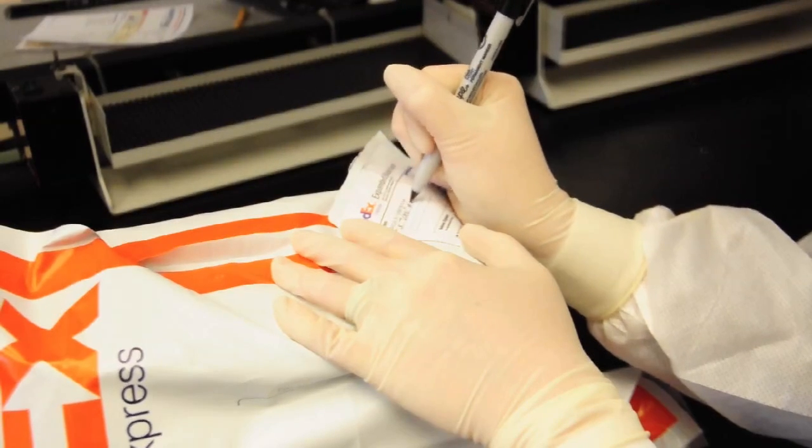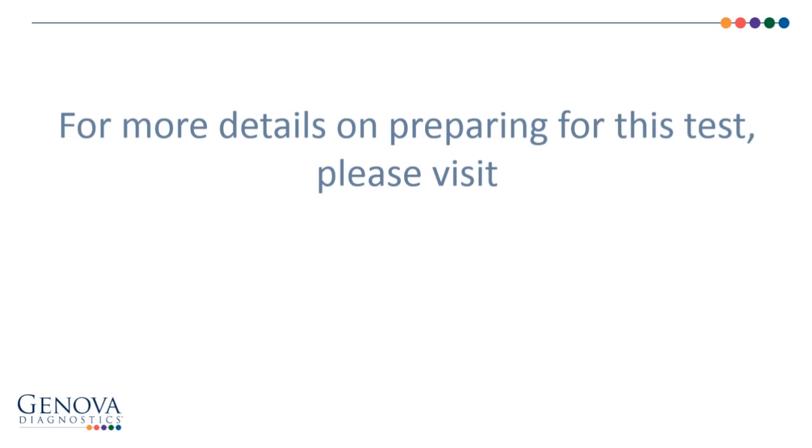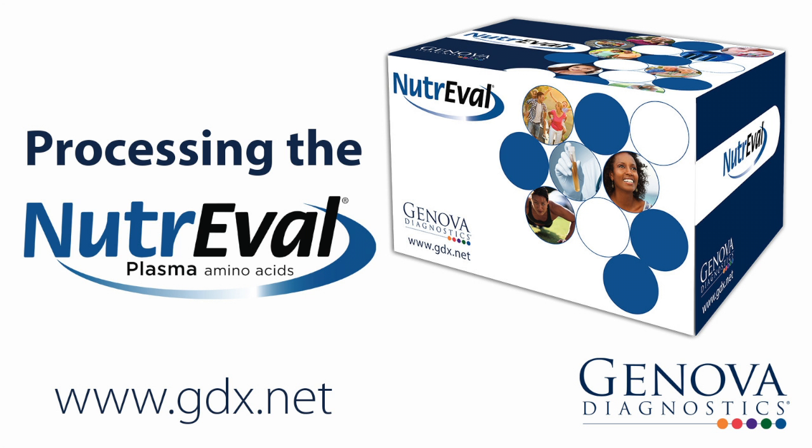Make sure the FedEx shipping label is completely filled out. For more details on preparing for this test, please visit our website at www.gdx.net/tests/prep. Thank you for choosing Genova Diagnostics.